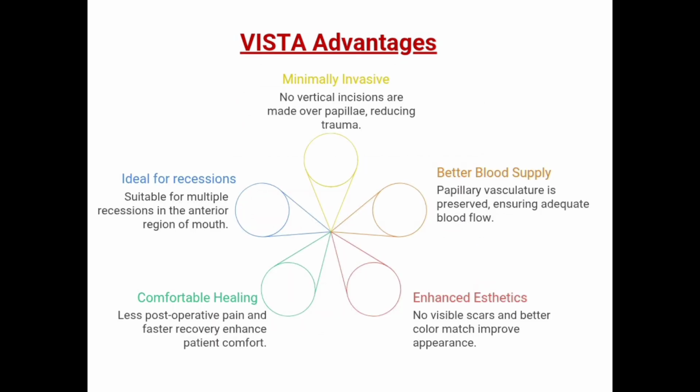The advantages of the VISTA technique are: it's minimally invasive because there are no vertical incisions made over the papillae. There is better blood supply because the papillary architecture is preserved. There is enhanced aesthetics since there are no visible scars and a better color match. There is comfortable healing, less post-operative pain and faster recovery, and it is ideal for recessions, especially in the anterior zone.